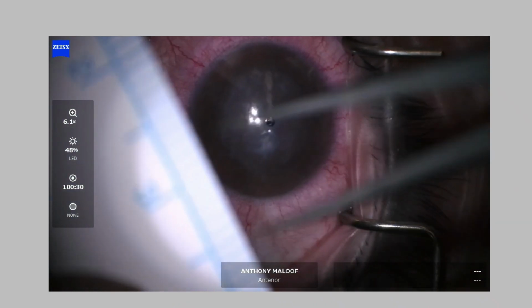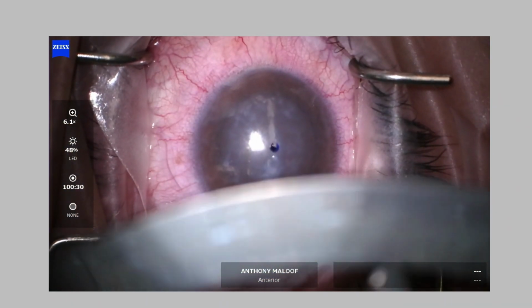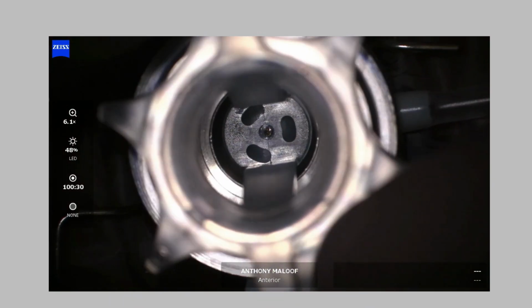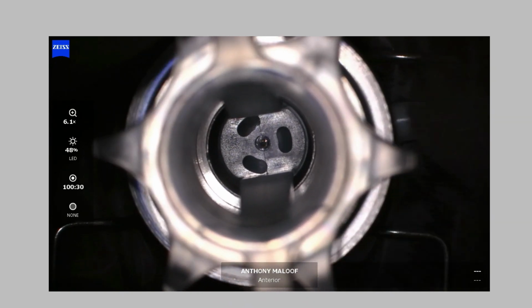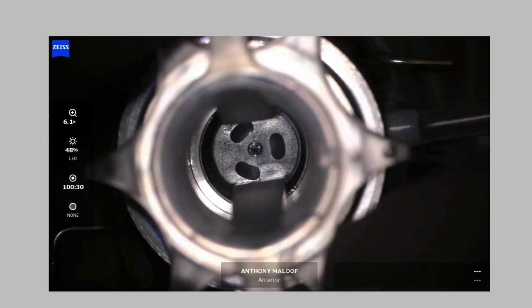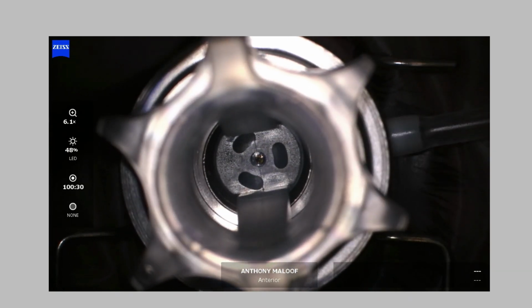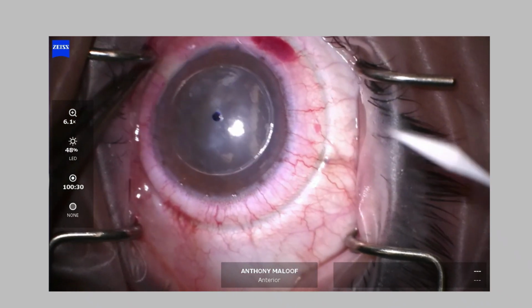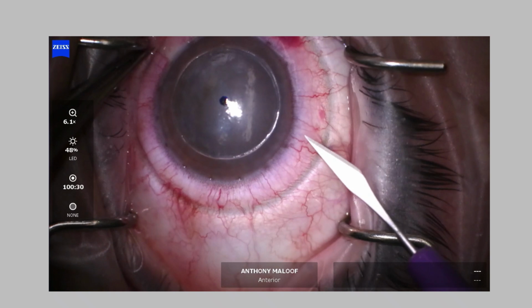What I'm doing is measuring, and I'm calibrating the measurement against a ruler because calipers are notoriously inaccurate, and here I've come down to select an 8mm caliper, an 8mm diameter, I'm sorry. This is a Moria disposable trephine, and this Moria trephine is set to 300 microns. So I trephine down to 300 microns. You'll notice that when I take it off, it leaves a ring around the sclera. That's because it sclerally fixates. It does not fixate on the cornea.